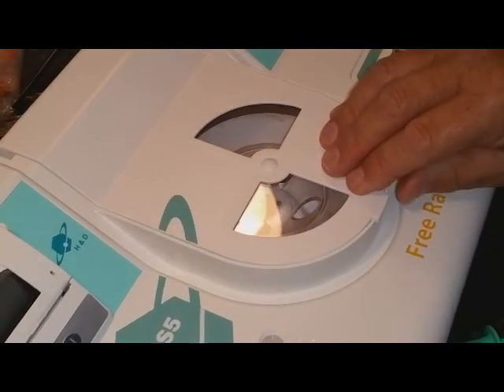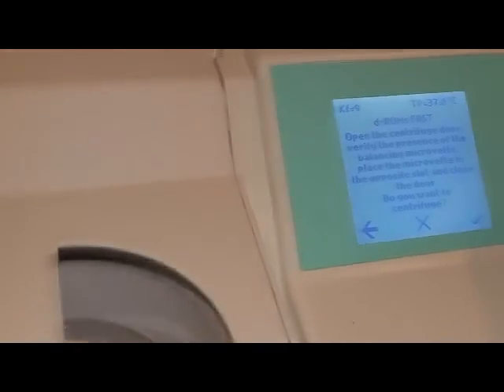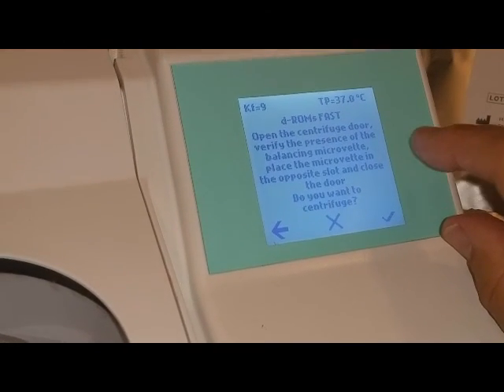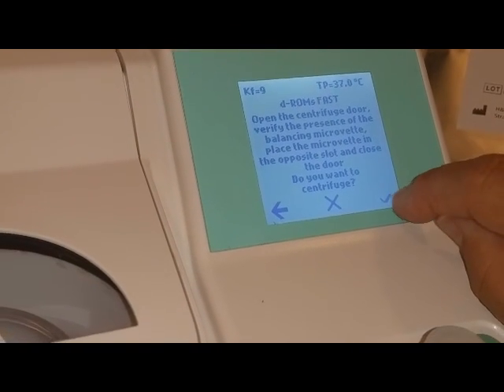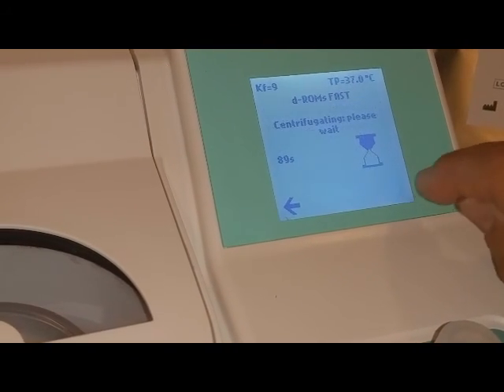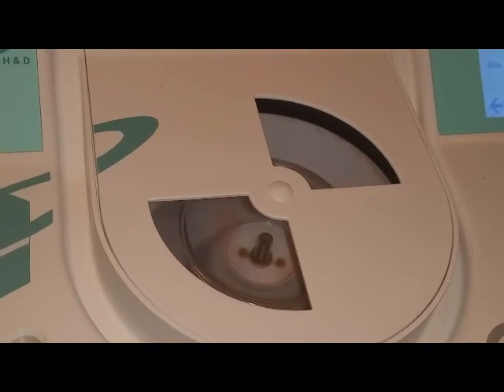Now it's balanced and I'm going to follow the next arrow. It says open centrifuge door, verify the presence of the balancing microvet, place the microvet in the opposite slot and close the door. I'm going to hit the check mark and it's going to start to centrifuge for about a minute and a half.